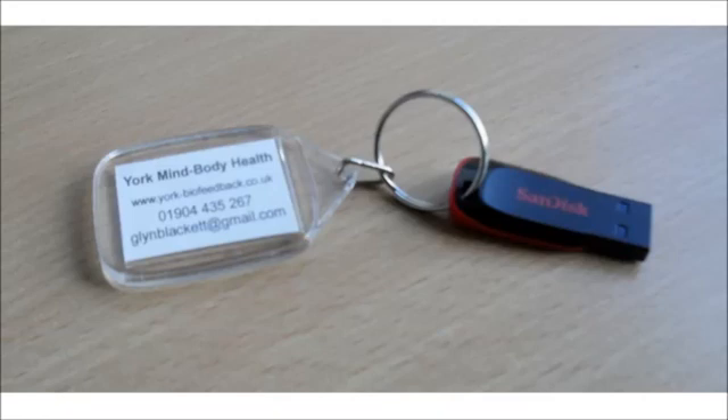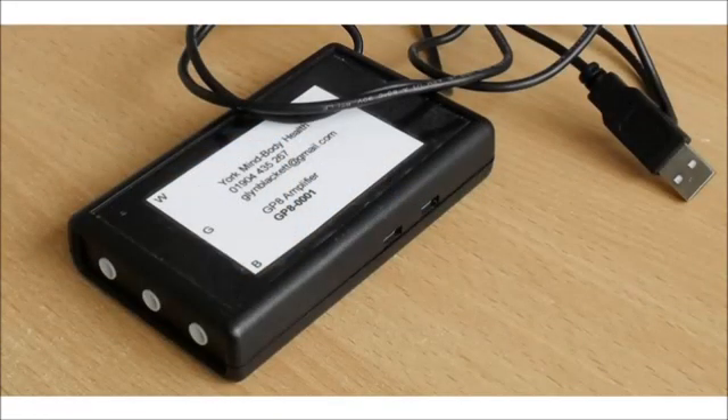I cover software installation and setup in a separate video. This device is called a GP8 amplifier. It can measure EMG for muscle tension and it's also used for HRV biofeedback, which we'll cover later in the course.